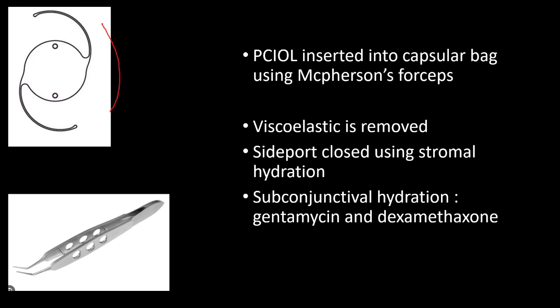The intraocular lens is placed in the capsular bag. For dialing the lens, we use the Sinskey hook dialer. For lens holding, we use McPherson's forceps. After IOL placement, all viscoelastic is removed using the two-way irrigation and aspiration cannula.